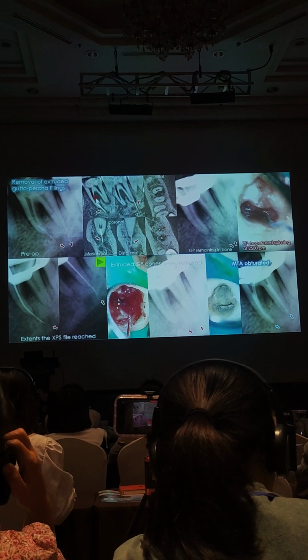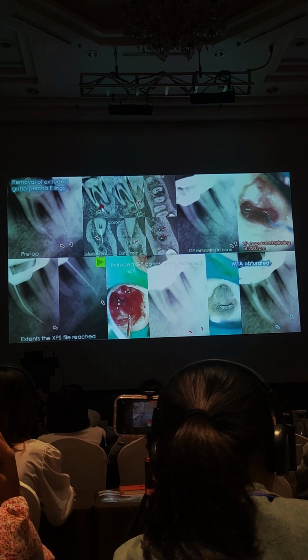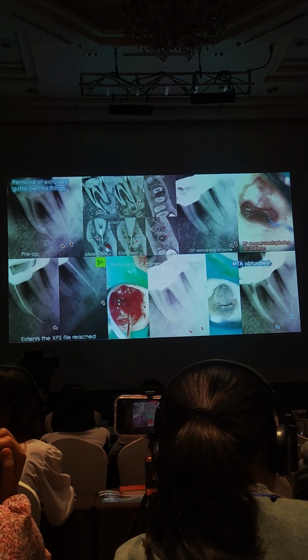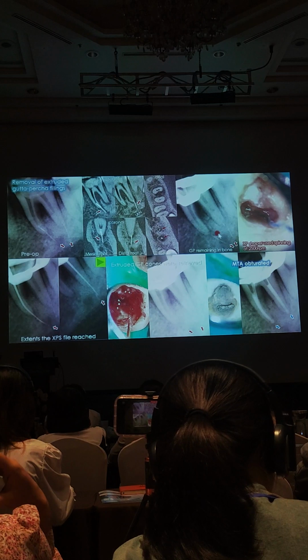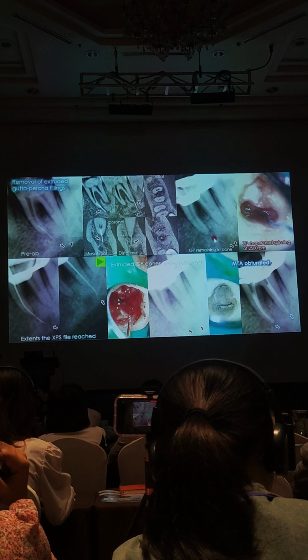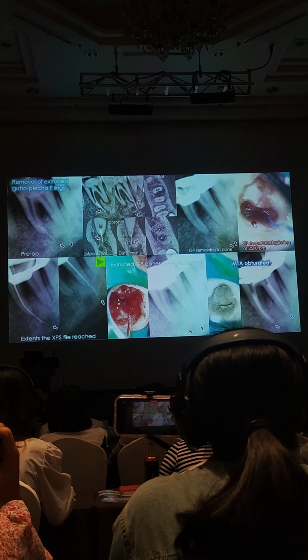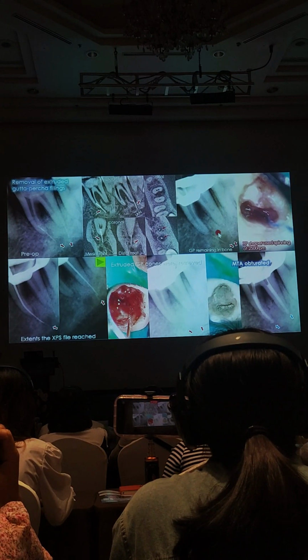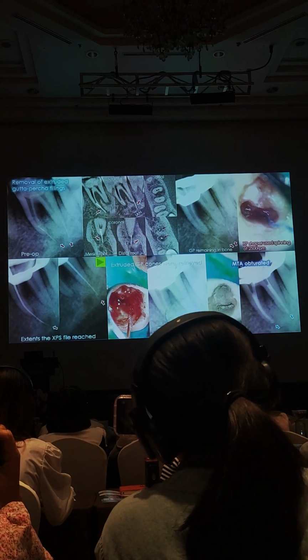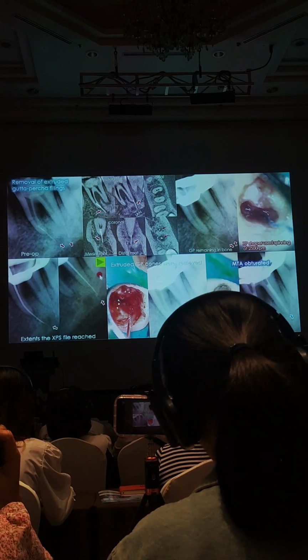First, I removed the gutta-percha inside the root canal, trying to remove it in one piece, but unfortunately, it was separated. Here, you see the gutta-percha completely separated. Then, this is plan B. Then I pushed chloroform into the periapical tissues. Then I spin the XP Shaper, 2,500 RPM.